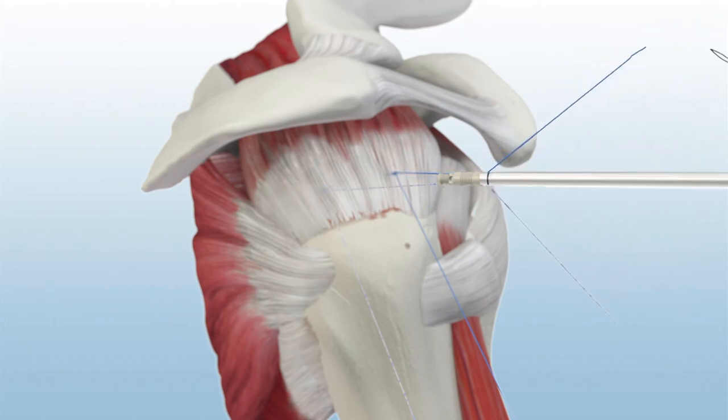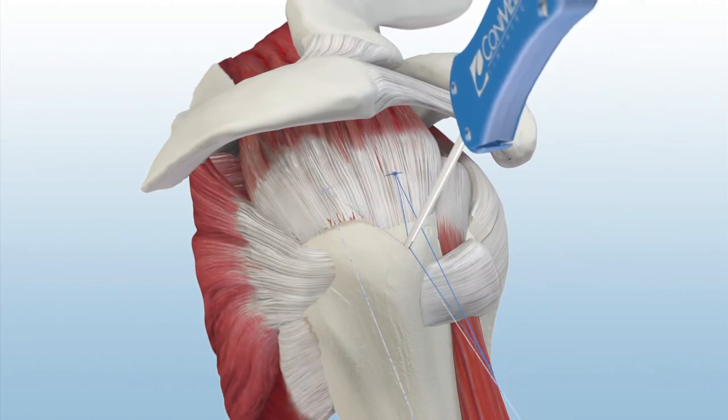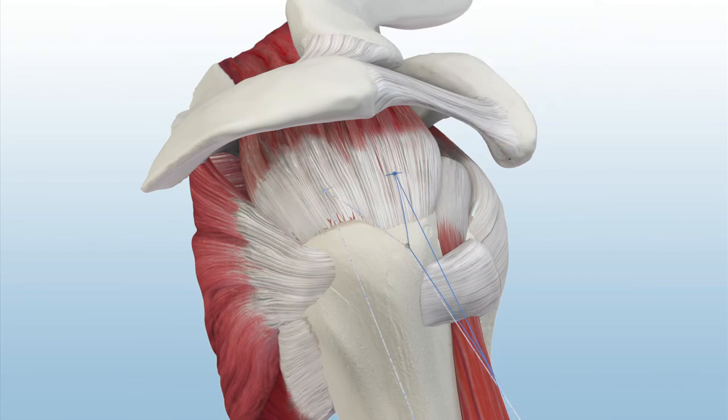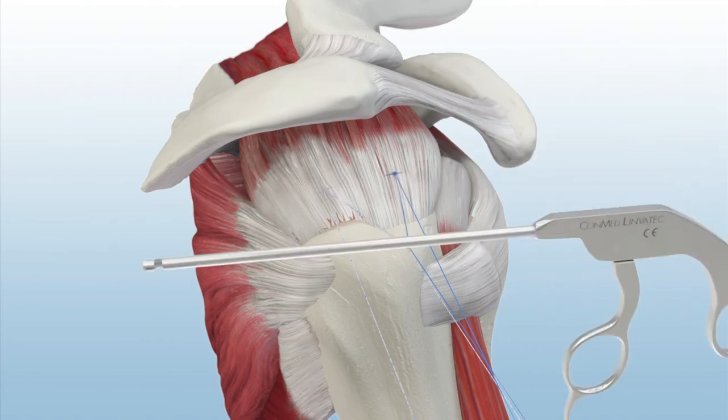The anchor is inserted down to the laser line and sutures are tensioned as needed. The pop-lock is deployed by squeezing the black handle, causing an audible pop to be heard. The suture tails are cut with a katana suture cutter.